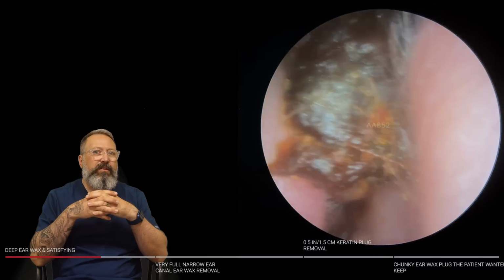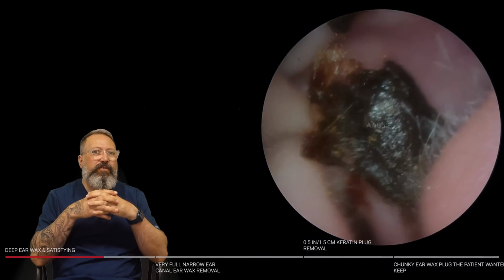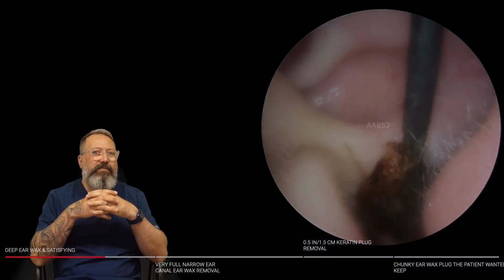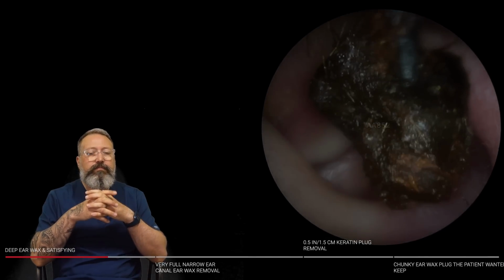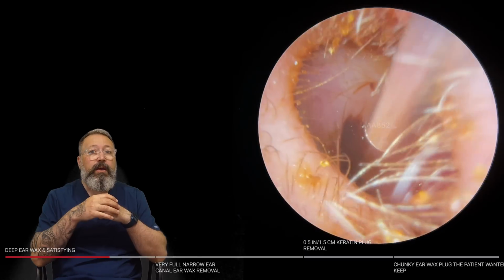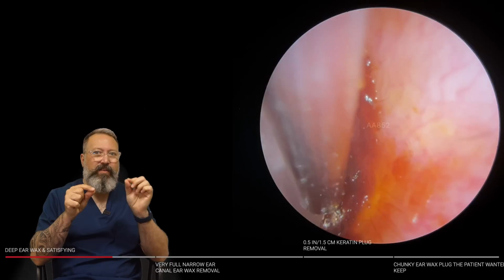Oh, trying to get a grip on this plug. Let's lift him again. It's a very sticky old plug. It's trying to adhere to every single bit of the ear canal there. There we go, out that comes. Nice and healthy there though. Let's take, this is a great peel. If you like a peel, this is a really, really good one.